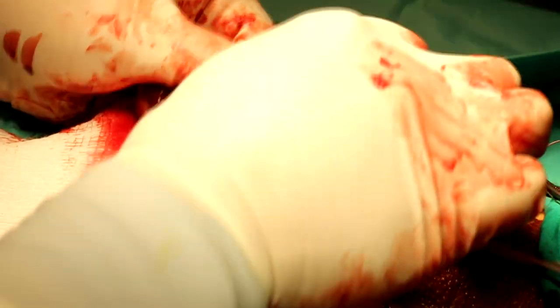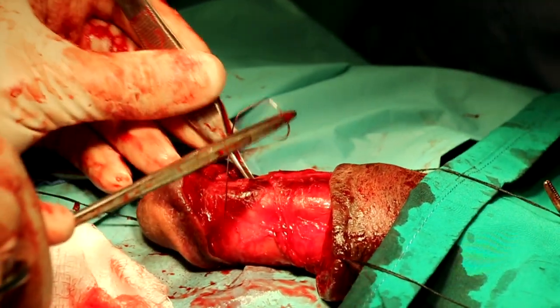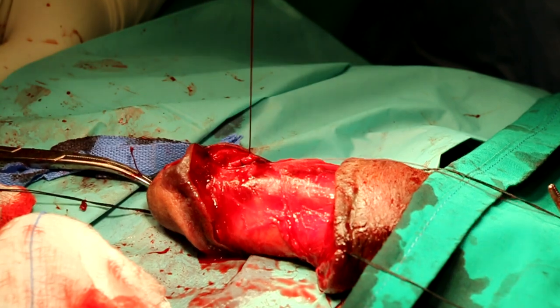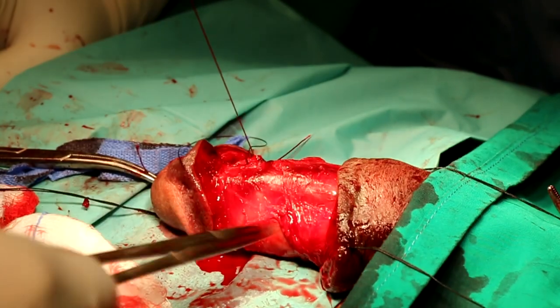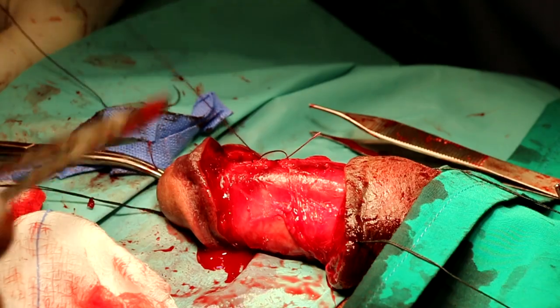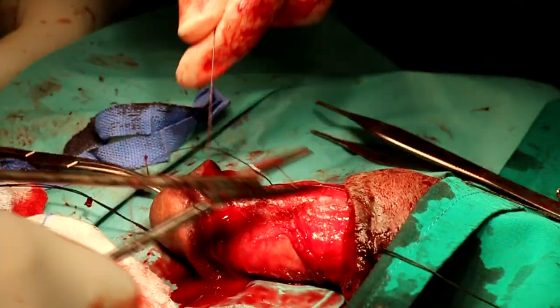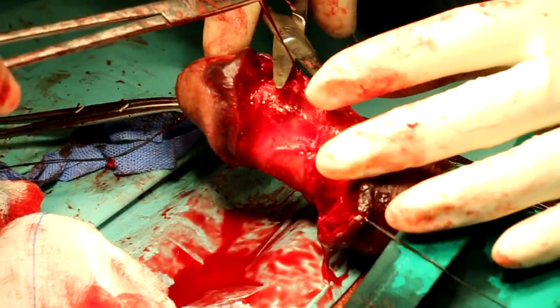Okay, now release of the tourniquet, and you may expect some bleeding, and I will comment on this point later on. Okay, closure of the fascia. I believe that all the layers that have been opened should be closed. So the closure of the fascia is important. It is an anatomical closure, returning everything to normal. And you see this area, I'm reinforcing the area of repair. So for any bleeding or hematoma, I expect that it will be compressed, tamponaded by the covering fascia. So close the fascia on both surfaces of the penis, ventral and dorsal.